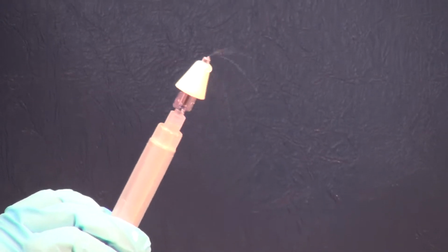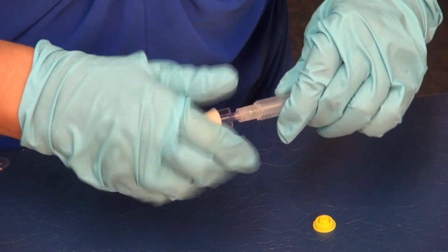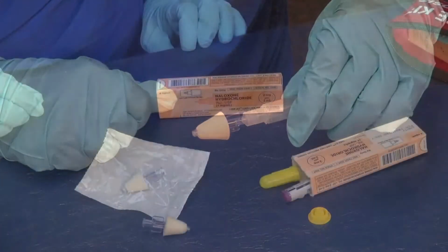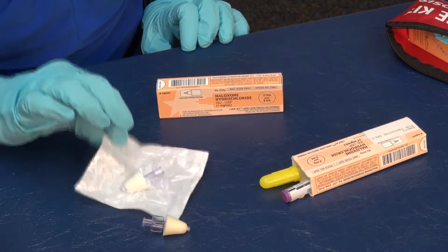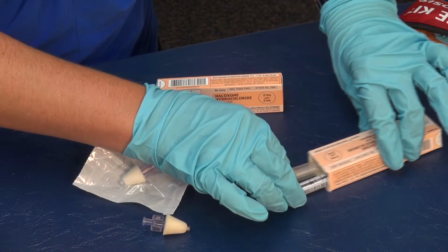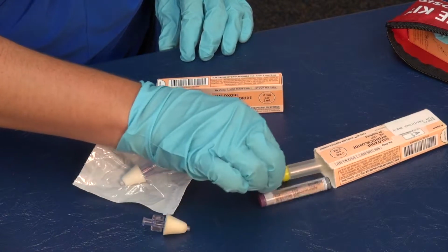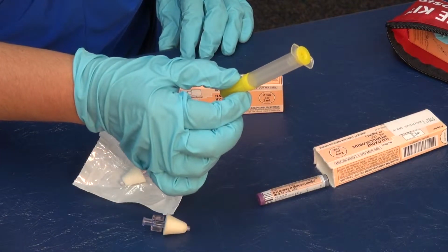The first intranasal formulation is an atomizer, which converts the liquid medication to a mist similar to a nasal spray. The atomizer assembly has 3 components and requires assembly. The atomizer comes separately packaged, and the remaining 2 components are inside the box: the medication in liquid form and the plastic housing into which it is inserted.